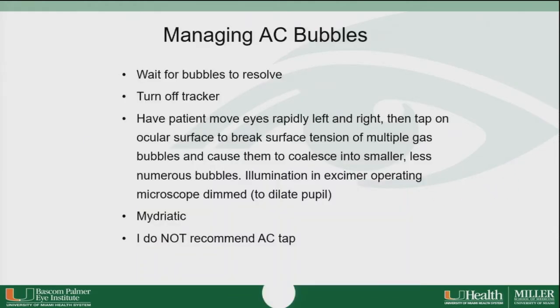You can wait for the bubbles to resolve, but this can take several hours. You can turn off the tracker if your excimer laser platform allows you to, but if you must use the tracker, you can have the patient move their eyes side to side or tap on the eye to try to get these small bubbles to coalesce into one single bubble, and then you can turn down your illumination light so you can start to get the diameter of the pupil larger than the diameter of the gas bubble.